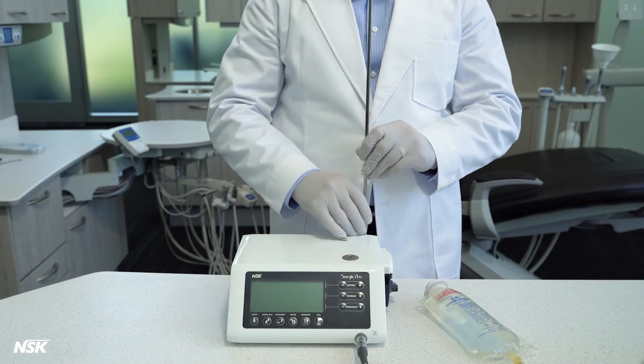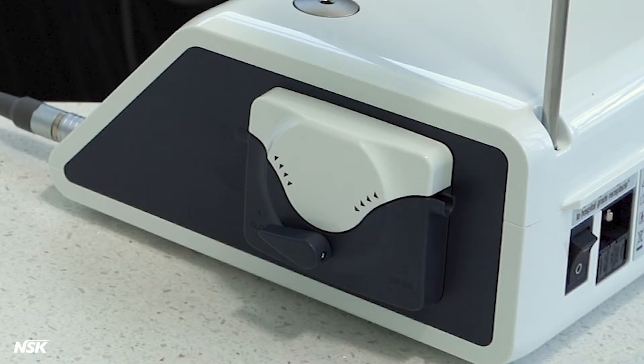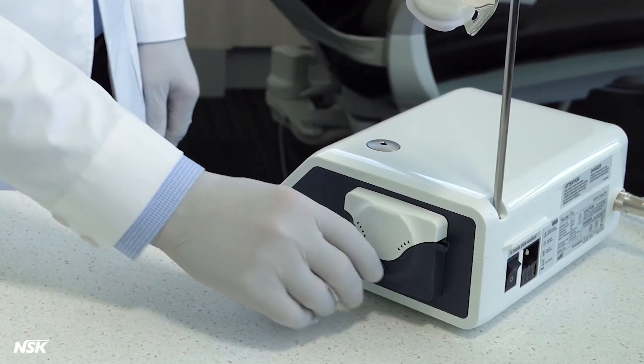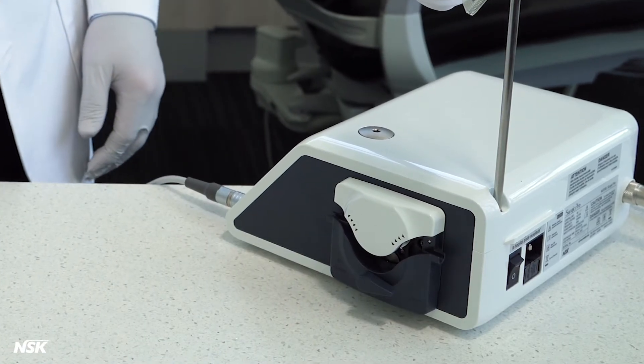Next, mount the coolant solution hanger post and hang the saline bag. To install the irrigation tube, be sure the lever of the pump is turned to open and the needle end of the tubing is facing toward the back of the unit.